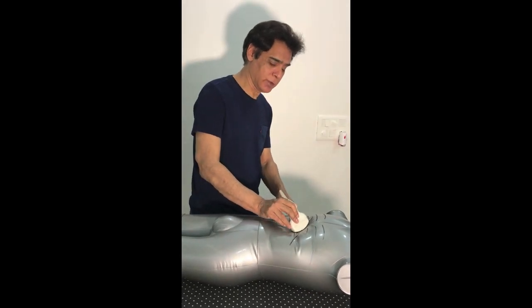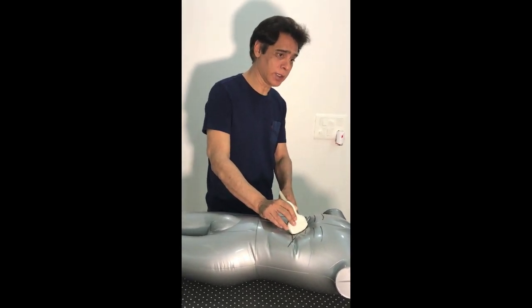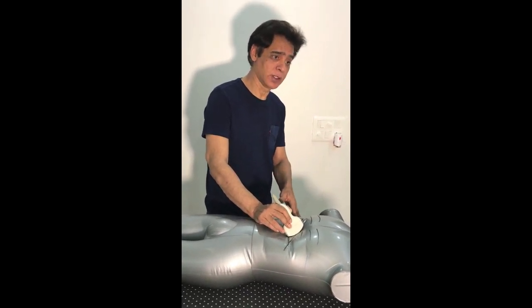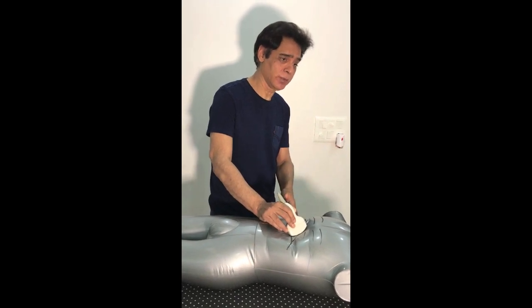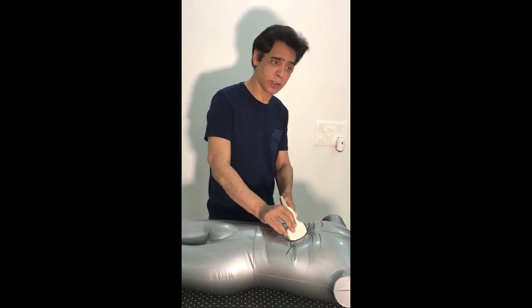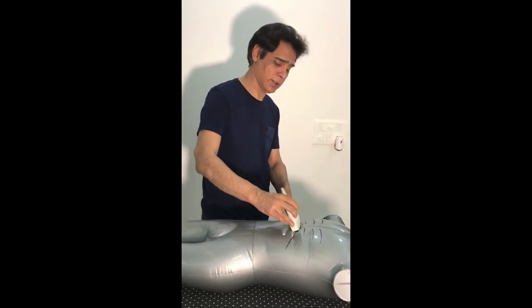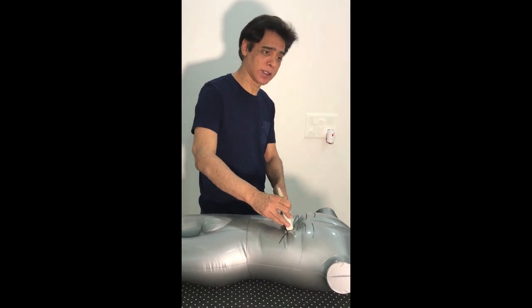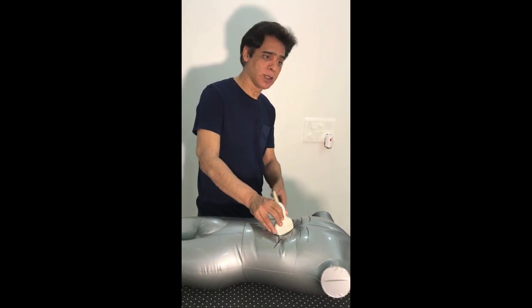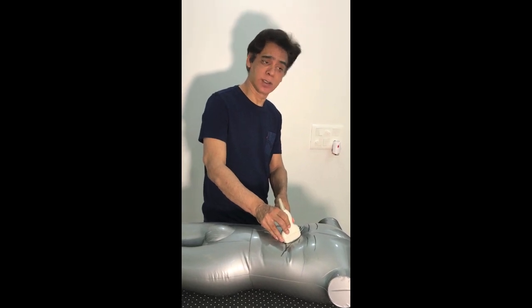So a little bit of right and left, maybe a little bit of rotation also, and here you can get the CBD in full length, and for a considerably longer duration, and as a result you will be able to spot the CBD much more easily compared to a transverse section, where you put the probe here in the transverse section of the pancreas and see it as a circular dot. Here when you get a longitudinal section, you see a long length, so it is much easier to identify the CBD.